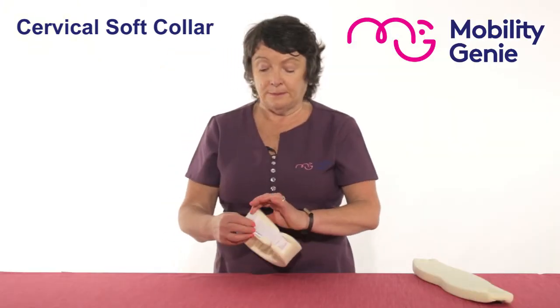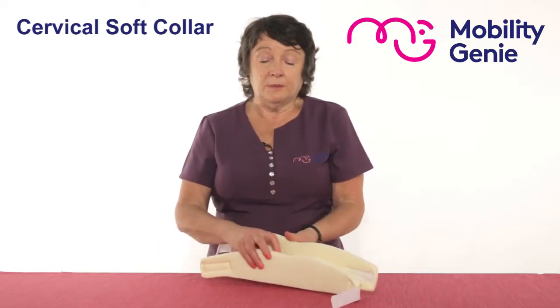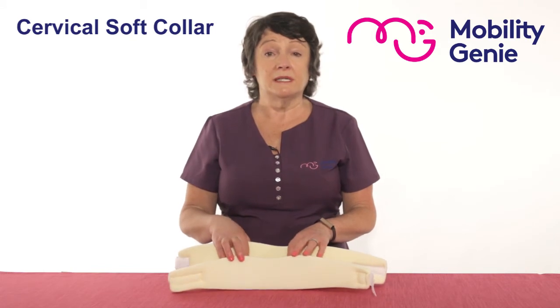For example, for somebody like me, with my height, I would be using the shallow collar because I have a short neck, and I would be using the medium length.